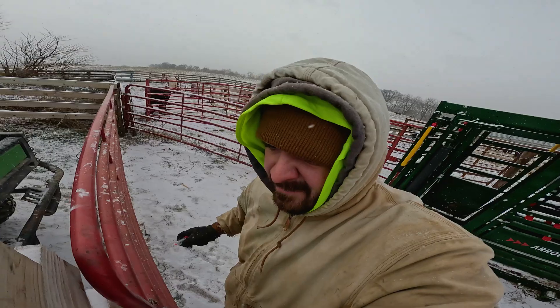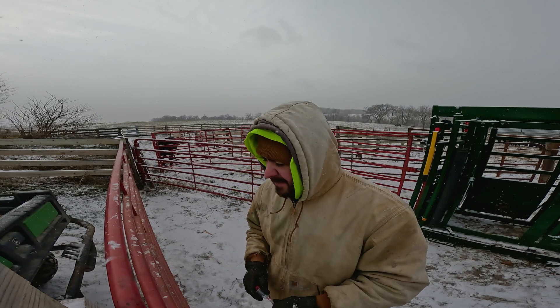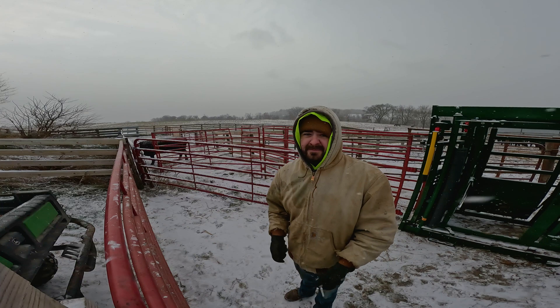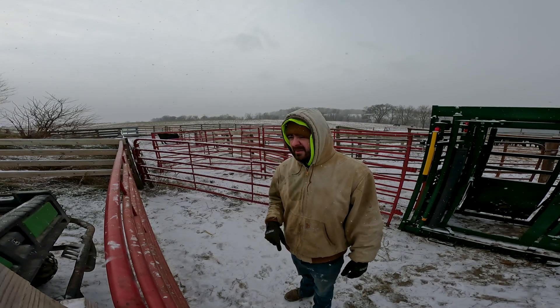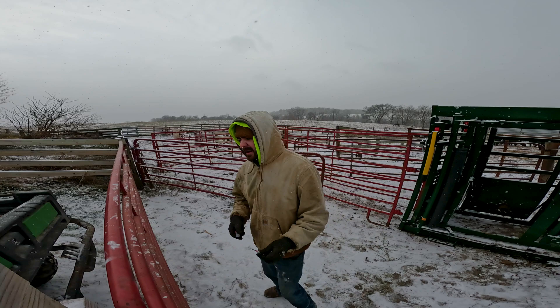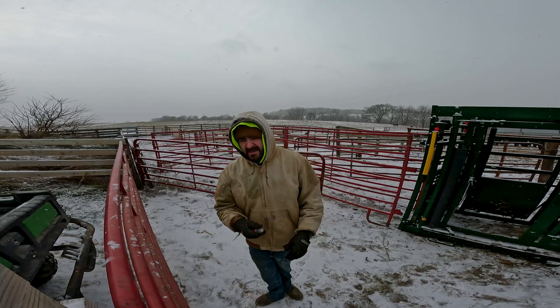That took a little bit longer because I was explaining everything, but usually it's real quick in and out and the cows don't seem to hold too big of a grudge. One thing I like to do is put a bucket of oats in front of them to keep them occupied — that seems to work pretty good too. That's how you collect blood. I've got 50 cows left to go and I'm hoping to have them all done this week. I'm really hoping to get these samples sent off because there's a bred cow sale. My intention is possibly to sell the cows that come back as open and then go buy bred heifers with the money, maintaining my herd numbers.